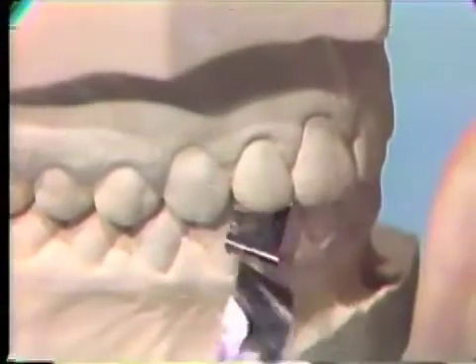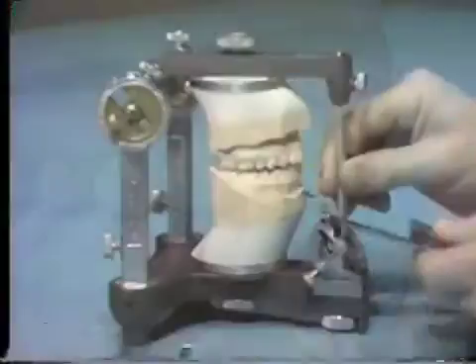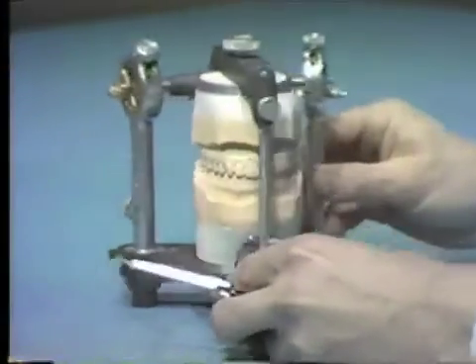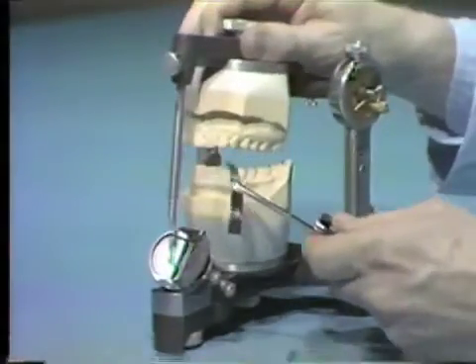There should be contacts between most of the opposing teeth if the casts are mounted correctly. If contact exists on both the left and right sides in the molar area and between at least two opposing anterior teeth, the mounting is acceptable. Failure to have bilateral contact or anterior and posterior contact will necessitate remounting the casts. Ideally, the mounted casts will have the same teeth contacting in central occlusion that are contacting in the patient's mouth.